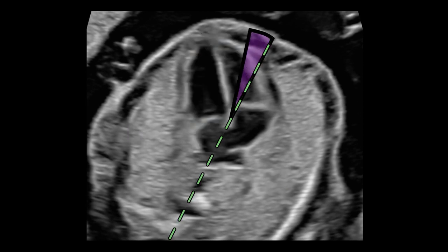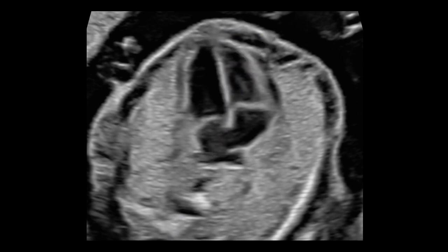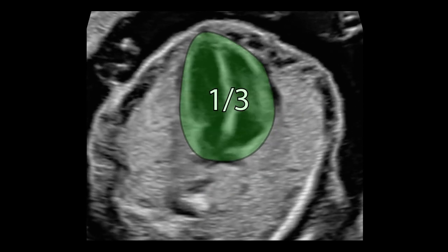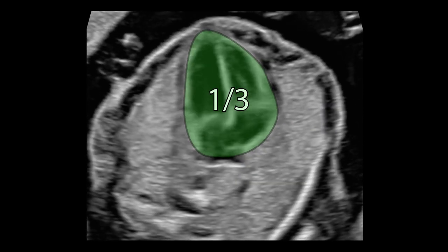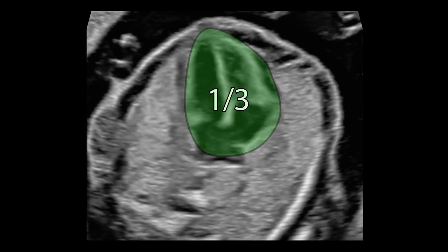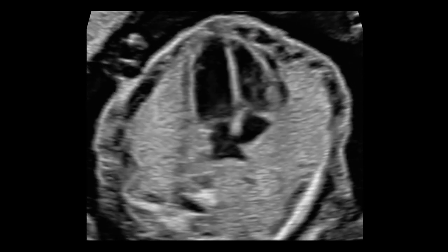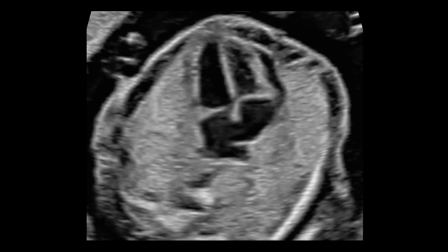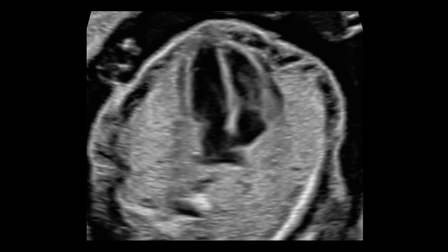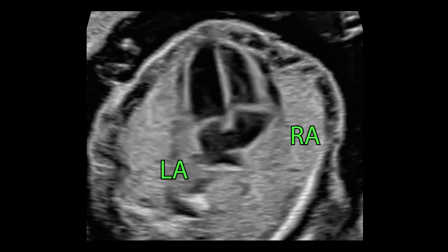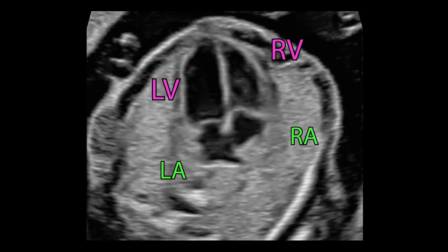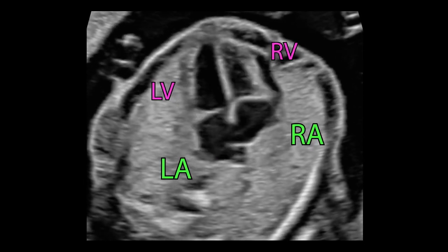The cardiac axis is 45 degrees plus or minus 20 degrees. The normal size of the heart is about one-third of the area of the chest. The heart beats regularly, and we confirm synchronous contractions of both atria and ventricles.